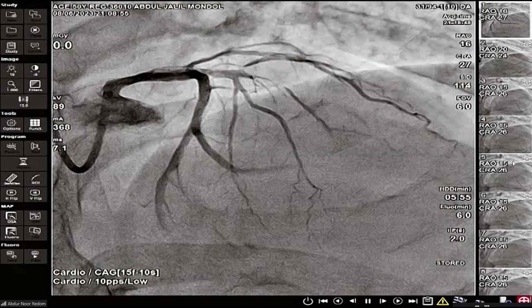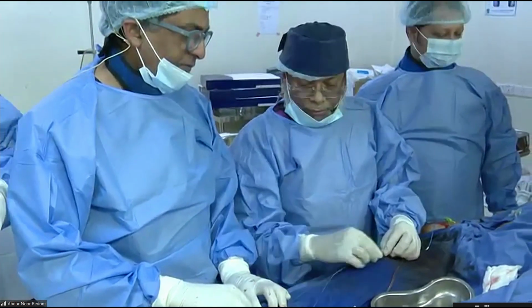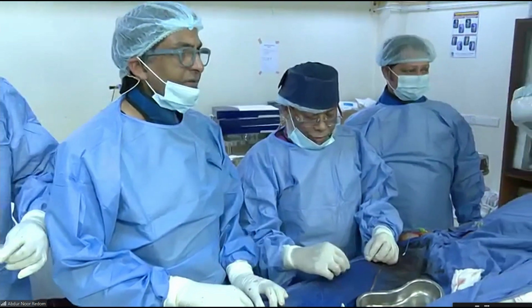I think the 4.0 is before the diagonal and before the septal. I'm not quite sure that it is 4.0 down there, but go ahead. Yes, sir. We are going for further pre-dilatation with a 2.5 millimeter NC balloon, because it is fibrotic.